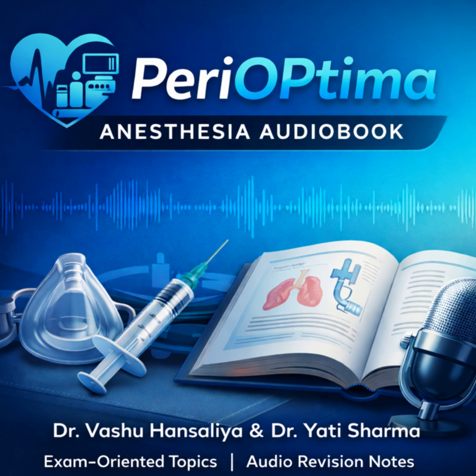Pre-hospital and emergency settings are a massive area of utility. During CPR, SGADs provide rapid, reliable airway security. Because they require minimal training for successful insertion, clinical or even non-clinical staff can secure the airway quickly, allowing for continuous chest compressions with minimal interruption.